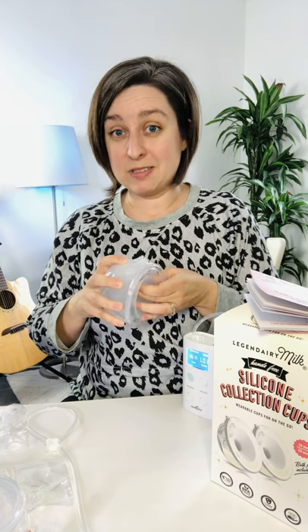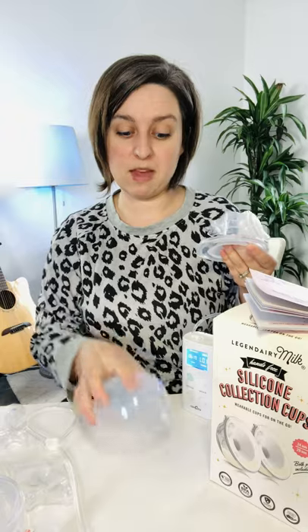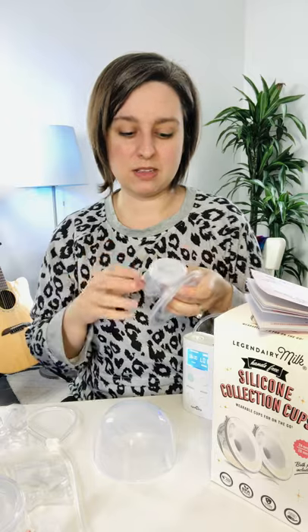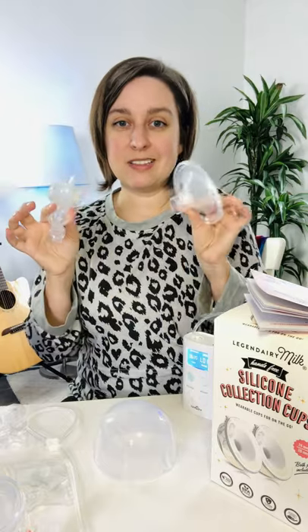There aren't that many open system pumps around anymore. The only big one I can think of is the Medela Pump in Style — not the Pump in Style Max Flow, which is their newer closed system version, but the older box-style Medela Pump in Style is open, and this would not work with that.